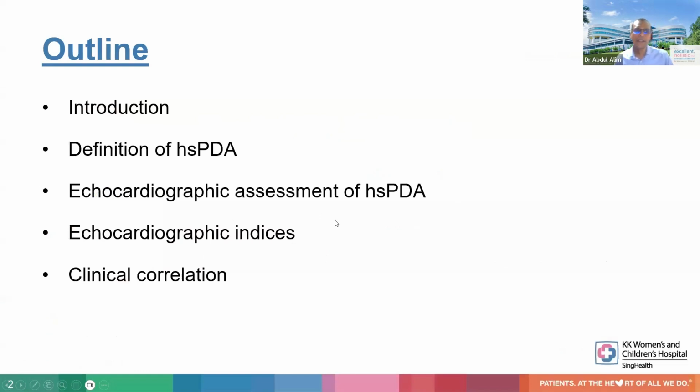So the talk is mainly divided into introduction and the definition of the hemodynamically significant PDA, echocardiographic assessment indices with lots of videos, and then practical tips and a few words about clinical correlation.